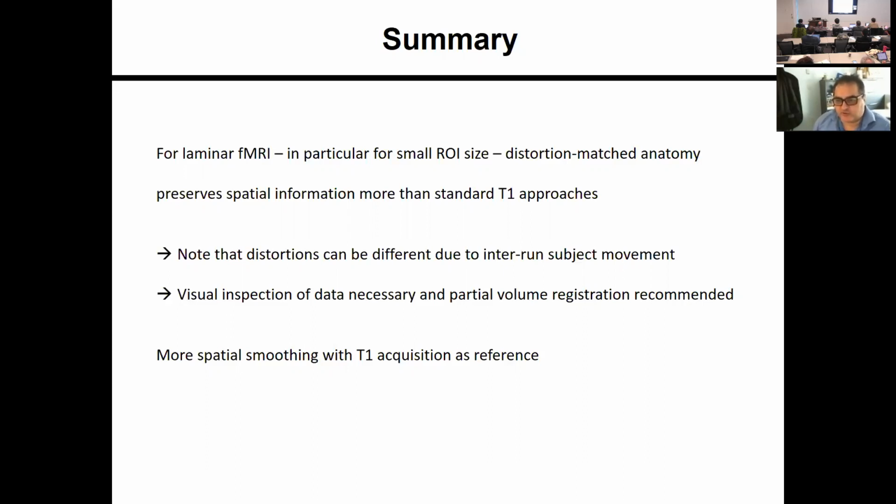Any other comments or questions? Renzo here. Maybe you can comment on the challenges or the practicability of using the T1-weighted EPI for automatic segmentation. From the images you showed, the EPI never really looks as visually appealing like the so-called anatomical MP2RAGE. It might be just more thermal noise or ghosting or something, it's EPI, right? So it's not as beautiful. How hard is it to push this through pipelines as you would for anatomical MP2RAGEs?